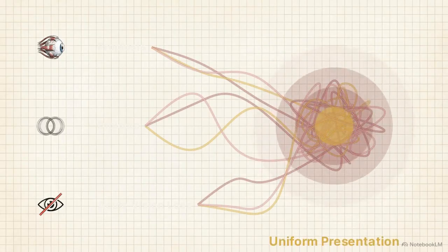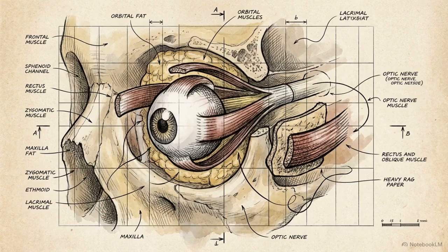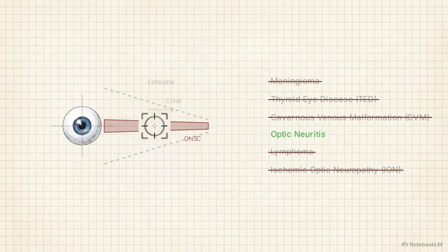of the underlying disease. Relying on this symptomatic overlap, or trying to group diseases into broad categories like neoplastic versus inflammatory, is highly unreliable. We have to abandon the symptom-first approach and instead filter these pathologies through strict spatial geography. By first isolating a lesion to a specific anatomic compartment and then applying targeted MRI functional signatures, we can systematically eliminate lookalikes and pinpoint the exact etiology.